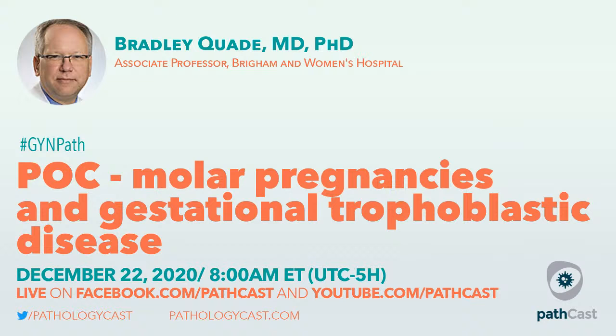I'm a little more bullish on the antibody, and I think it's a reasonable tool, unless you're maybe thinking about it in more of a research environment. So if you have access to the antibody, if it's working well in adult type specimens, and you have placentas for which you're concerned that it could just be a placental infection, go ahead and stain it.